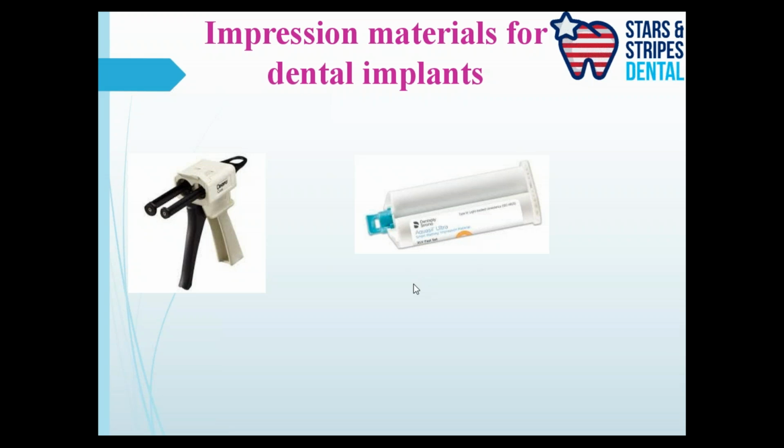So there are materials out there which provide the tube format, where you just push a rope of base and a rope of catalyst according to the manufacturer's instruction. Then you hand mix it on a pad or something like a glass slab, or you can go for these kinds of cartridges, which are made for a dispenser gun. These cartridges are pre-titrated. That means you don't have to worry about taking out a certain amount of base and a certain amount of catalyst, because it is pre-mixed, it is pre-formed.